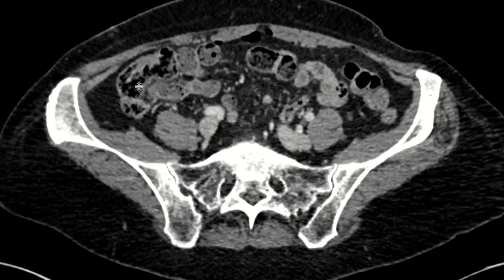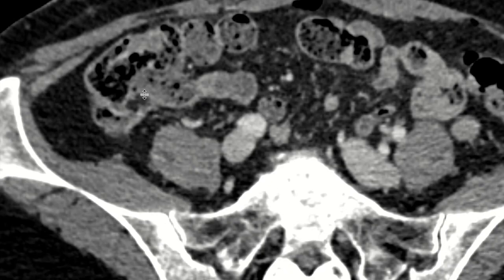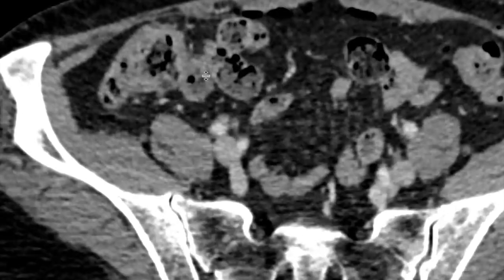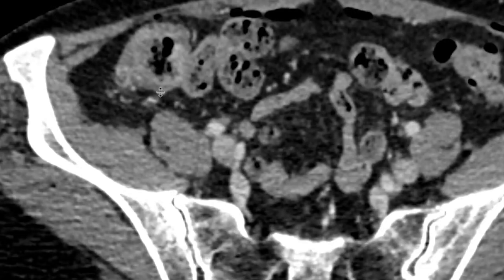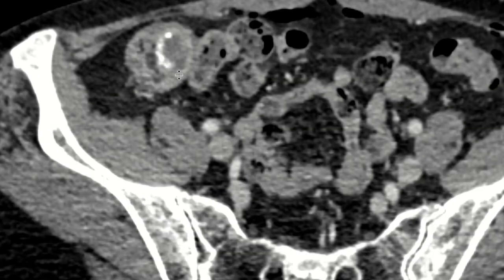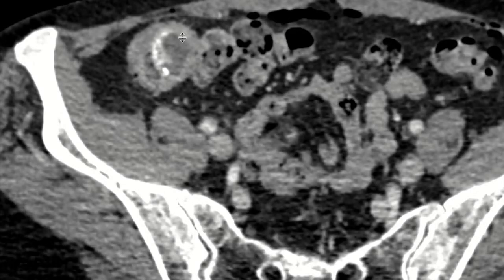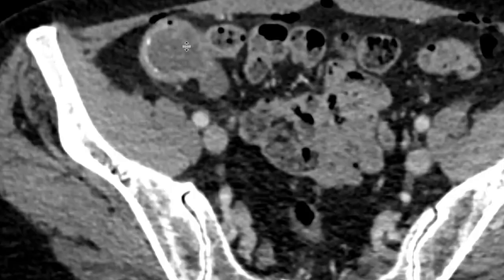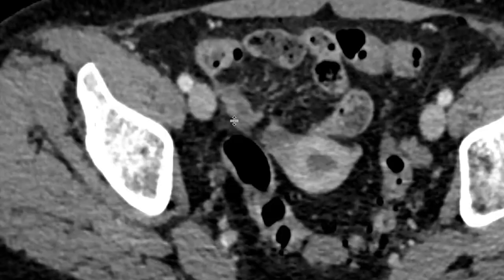And so here you can see the ileocecal valve right here. There's some fat that's coming around there, and then this is your terminal ileum. And when you come further down on the cecum, that's where you expect the appendix to come out, the same side as where the terminal ileum comes in. And we can see that there's a really thickened appearing appendix that's emanating off of the cecum.